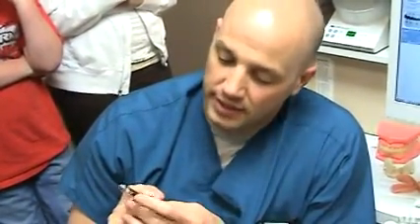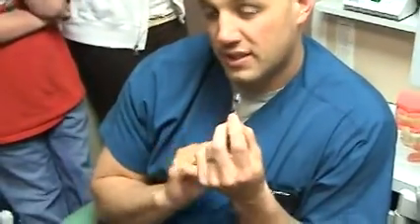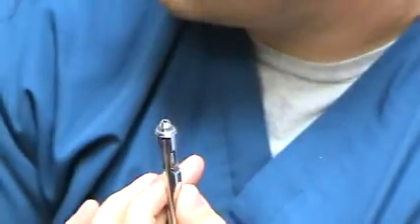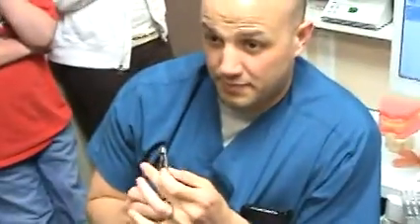Is it the numb? Yep. And then do you see the end of it here? Do you see that harpoon there? I never knew that it was a needle. And then I went to the dentist and I didn't want to get a shot. Yeah. Okay, so that harpoon, there's a plug on the end of a carpule of anesthetic.